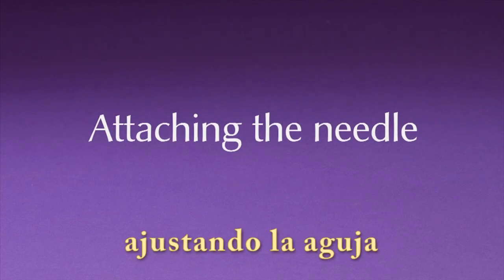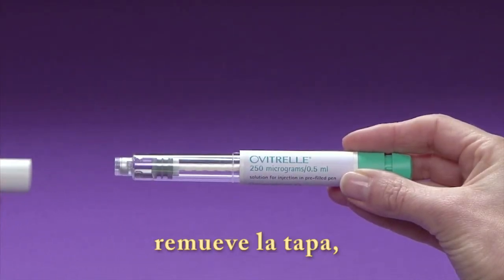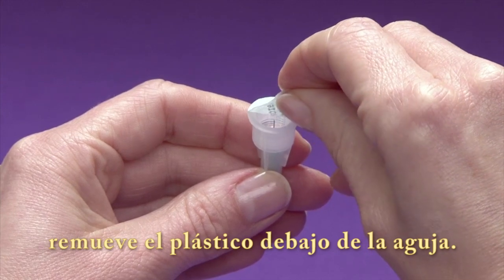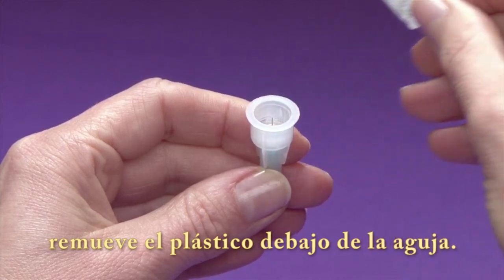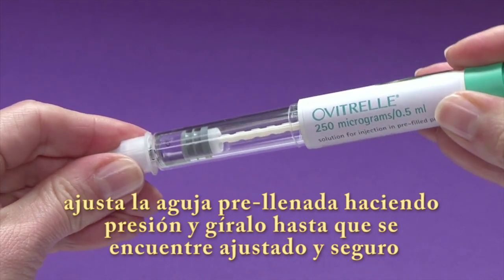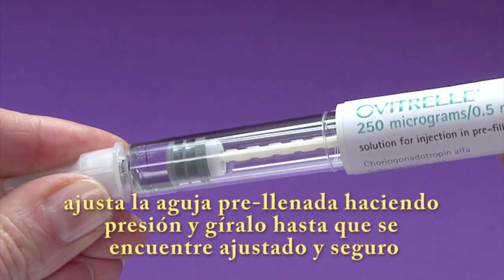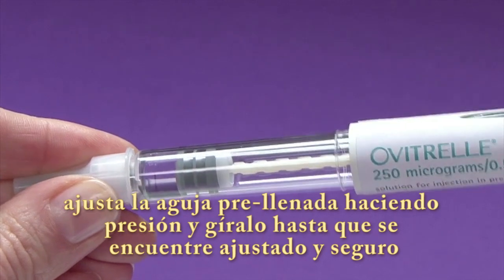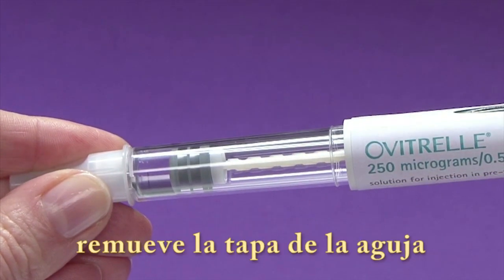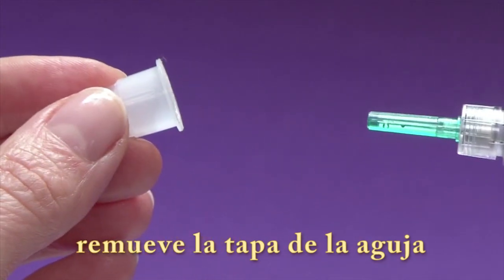Attaching the needle. Remove the pen cap. Remove the peel-off seal from the outer needle cap. Attach the needle by pressing the threaded tip of the pen into the outer needle cap. Screw it until it is firmly locked in place. Remove the outer needle cap.